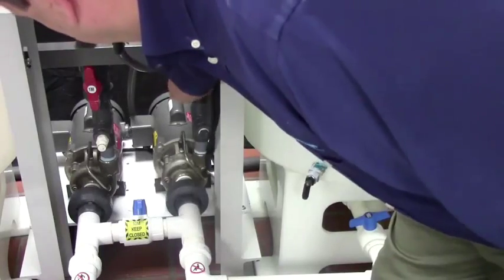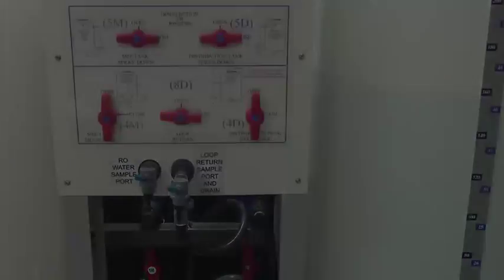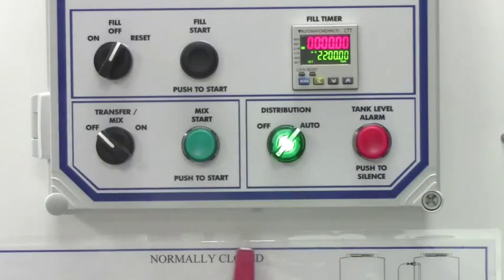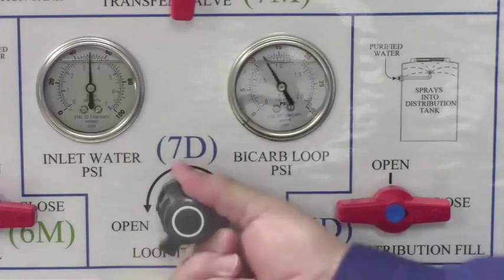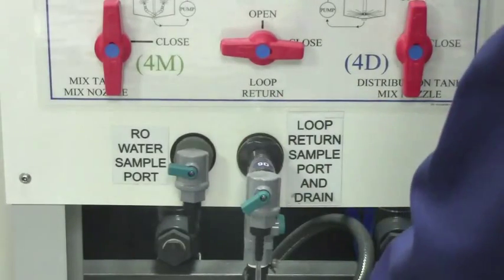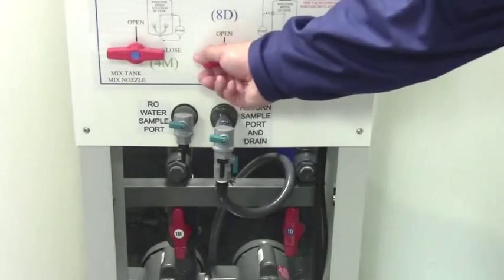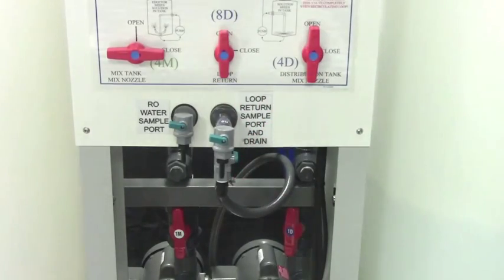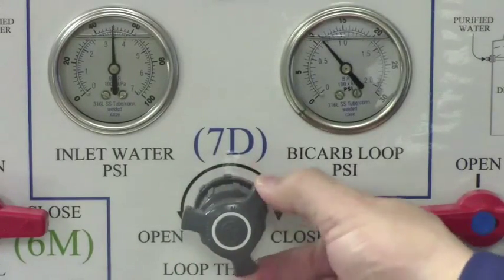Open valves 1D, 10D, and 4D. Turn the distribution switch to auto. Fully open 7D until the bicarb loop gauge reaches maximum pressure. Then open 9D. Open the loop return sample port to test for the presence of bicarb. Once bicarb is present, open 8D and close 9D to begin distributing solution through the loop. Turn valve 7D to adjust the bicarb loop pressure so the gauge is between 4 and 6 PSI.